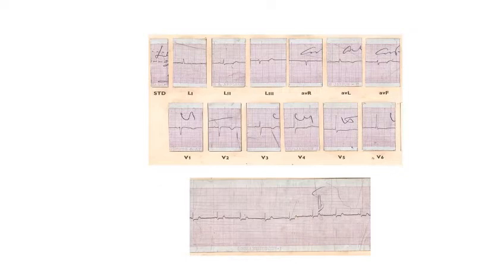Sir, this is a 12 lead standard ECG, which is showing a rate of around 100, and a short PR interval, around 100 milliseconds. Why did you say PR is short? Because if you look at the PR here, in the rhythm strip, it is short. Okay, right.